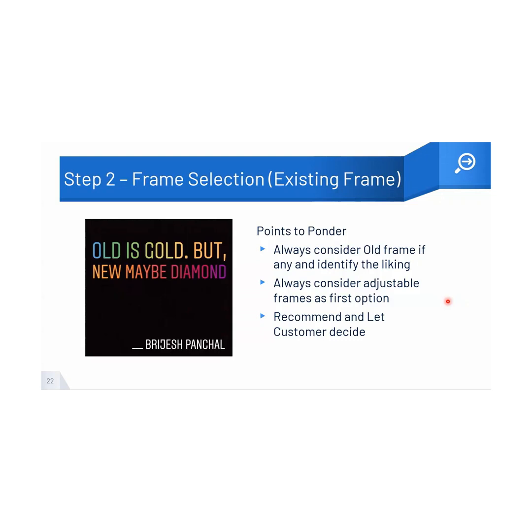But in an optical environment, glasses are considered accessories, and people want to uplift their overall looks with the spectacle, so they may end up with frames which are really challenging.